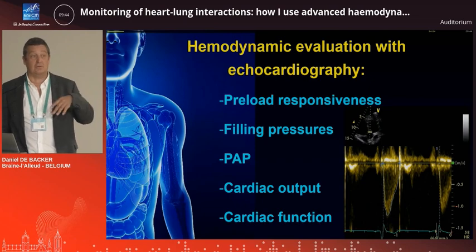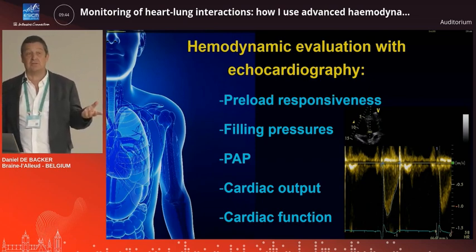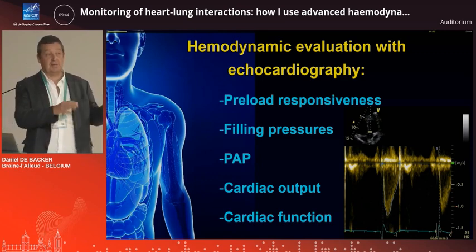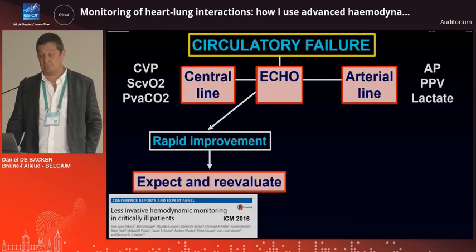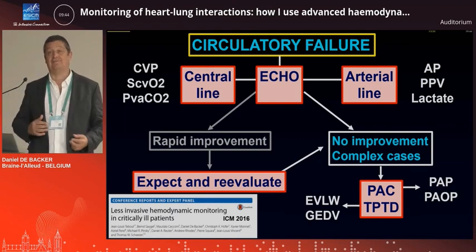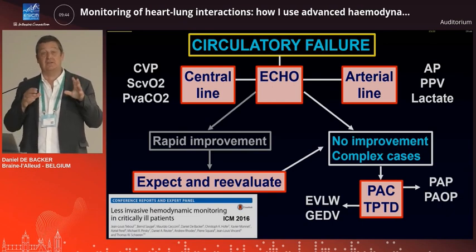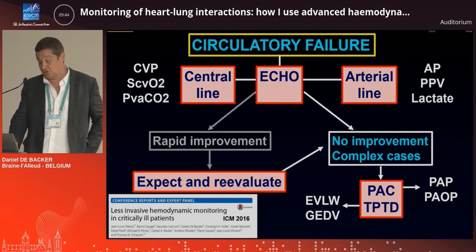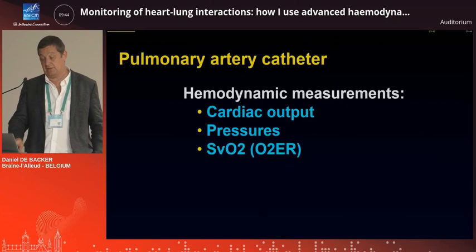When I do the echo, apply, measure, reevaluate, it takes me 25, 30 minutes. And I'm not doing anything else with the other patients, not talking to the family. Oh, I have to do a lot of things there. So indeed, it's good to have also some other monitorings. That's why we also want aspects that can be nurse-driven and not only dedicated to the doctor evaluating the echo, interpreting and making all those things.